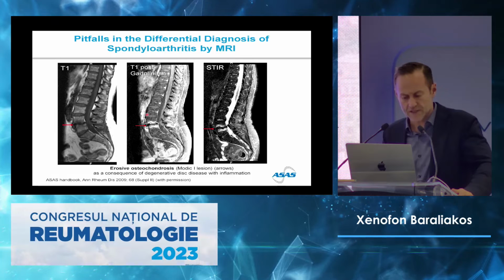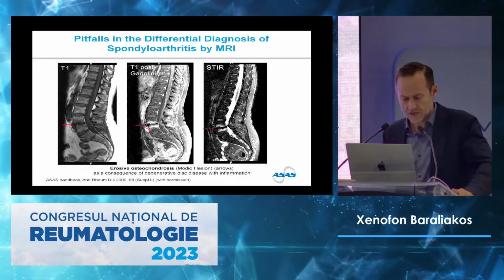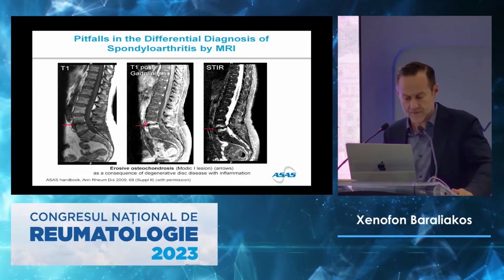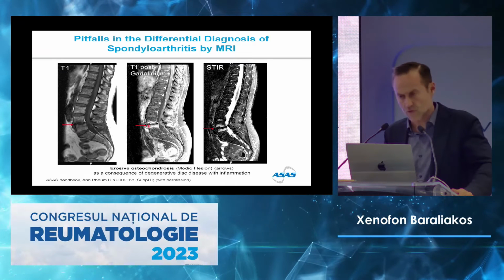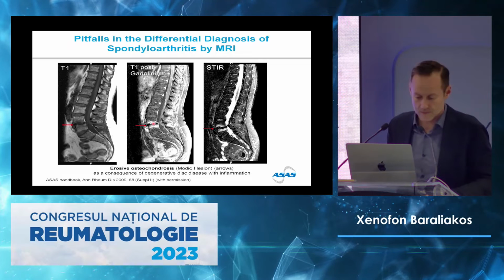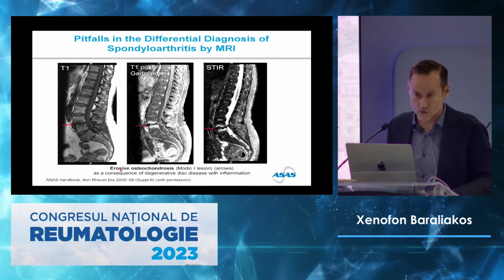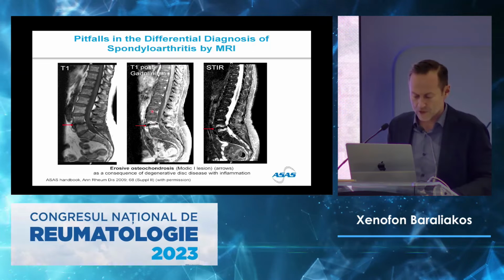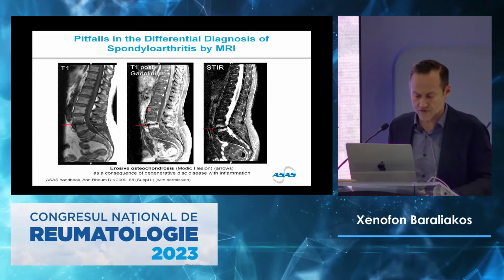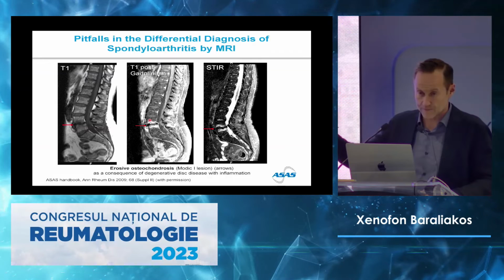The spondyloarthritis edema is staying at the edge. So this is really affecting the entire segment with, in that case, degeneration of the disc. And that is a typical osteochondrosis with erosion. Yeah? The spondyloarthritis patient would have those findings here, or maybe like a triangle, not like a line.